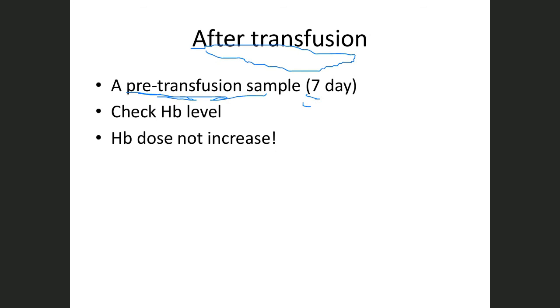Why do we have to keep it 7 days? What do you think? For testing? No, we already finished the testing; this is after the transfusion, and I didn't discard it. So the pre-transfusion sample, excellent.